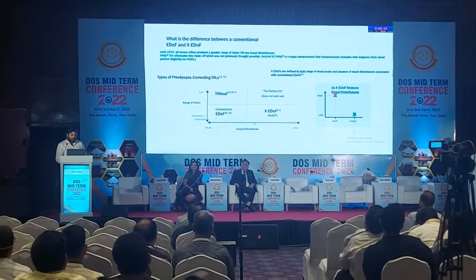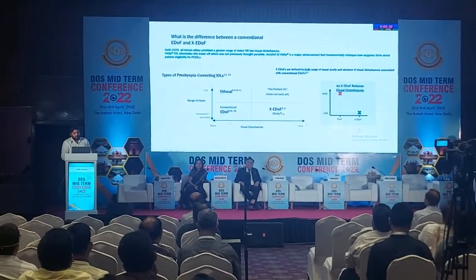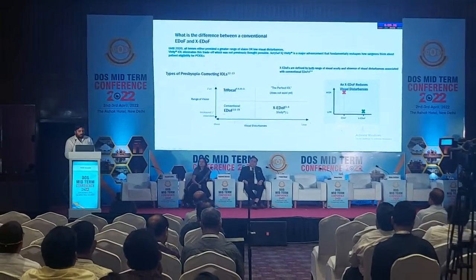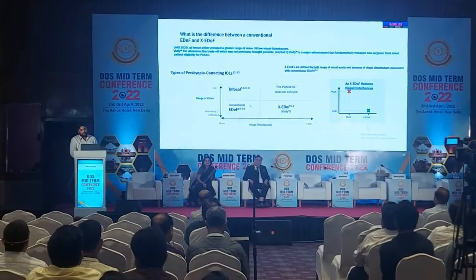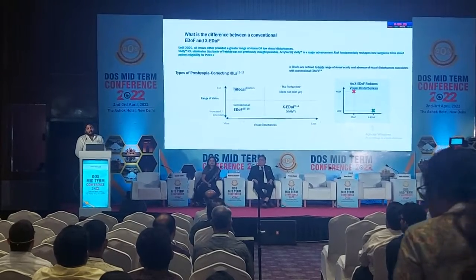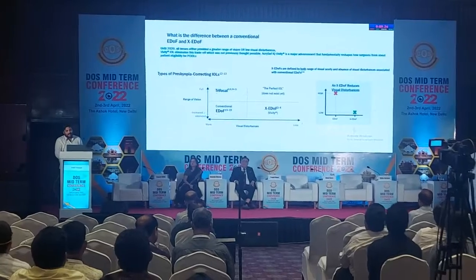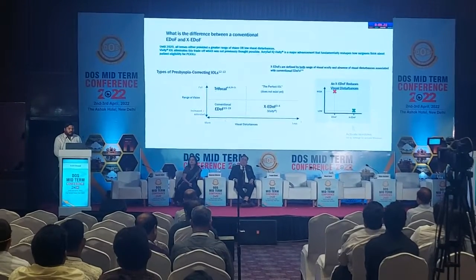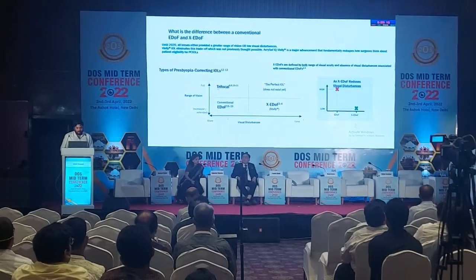Whereas with the newer platform, because of the wavefront delay, those problems are less. But at the same time, the range of vision is also less. So, what is a perfect IOL? I would say that it does not exist. A perfect IOL would give a full range of vision for all distances and have no visual disturbances. So there is no perfect IOL as of date.